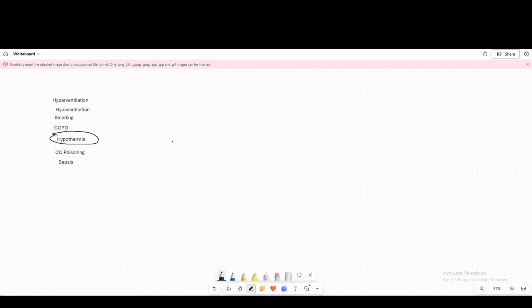So in EMT school, they teach you to rub the finger if it's feeling cold before you put the saturation probe on, because if someone's really hypothermic and you stick the probe right on, it might read something crazy low, like 84%, right? And that's because you have that vasoconstriction, because of the cold, which decreases the blood flow to that particular site. So these patients just want to warm up a little bit, and maybe don't take the reading as law. Again, talk to your patient.